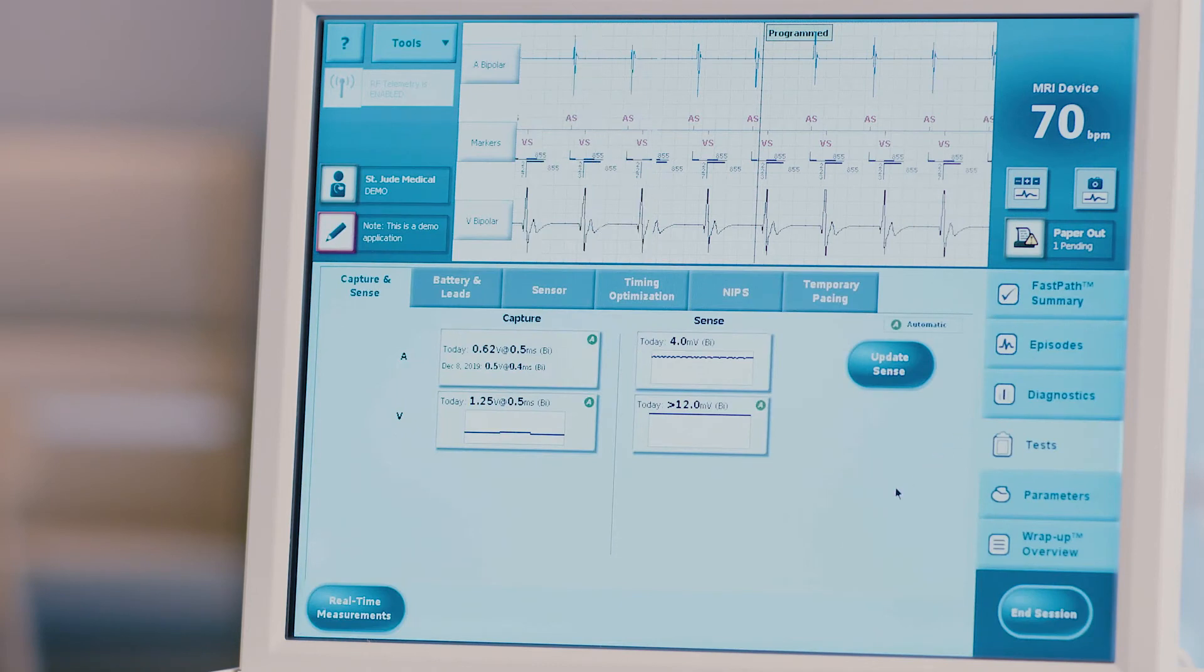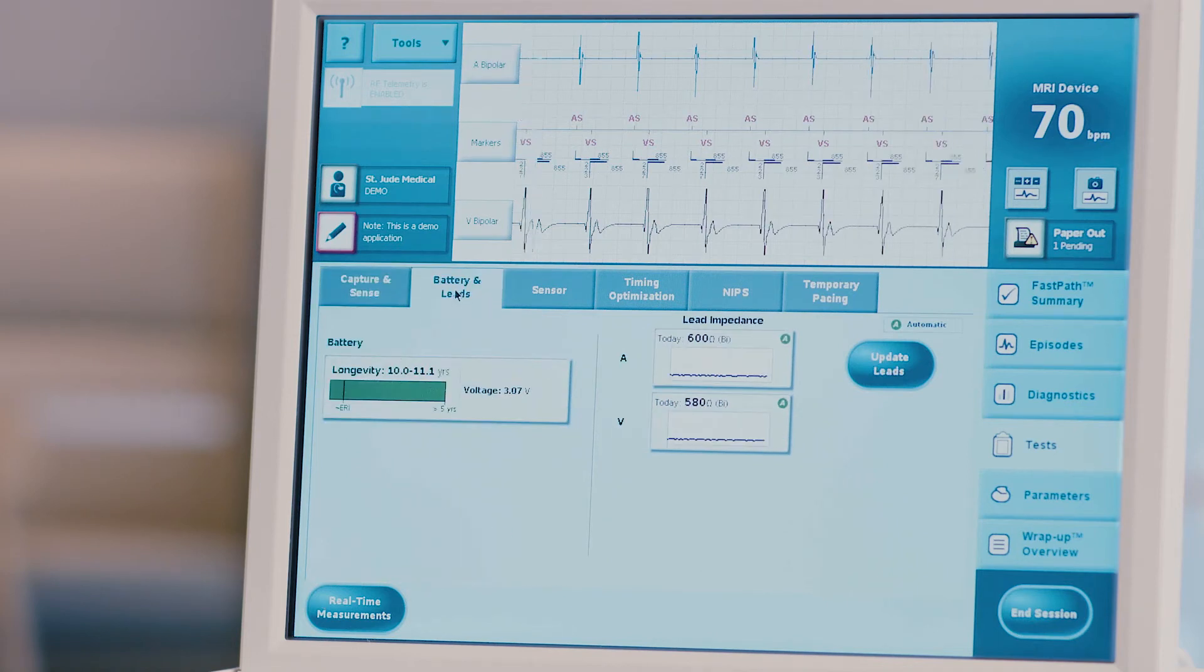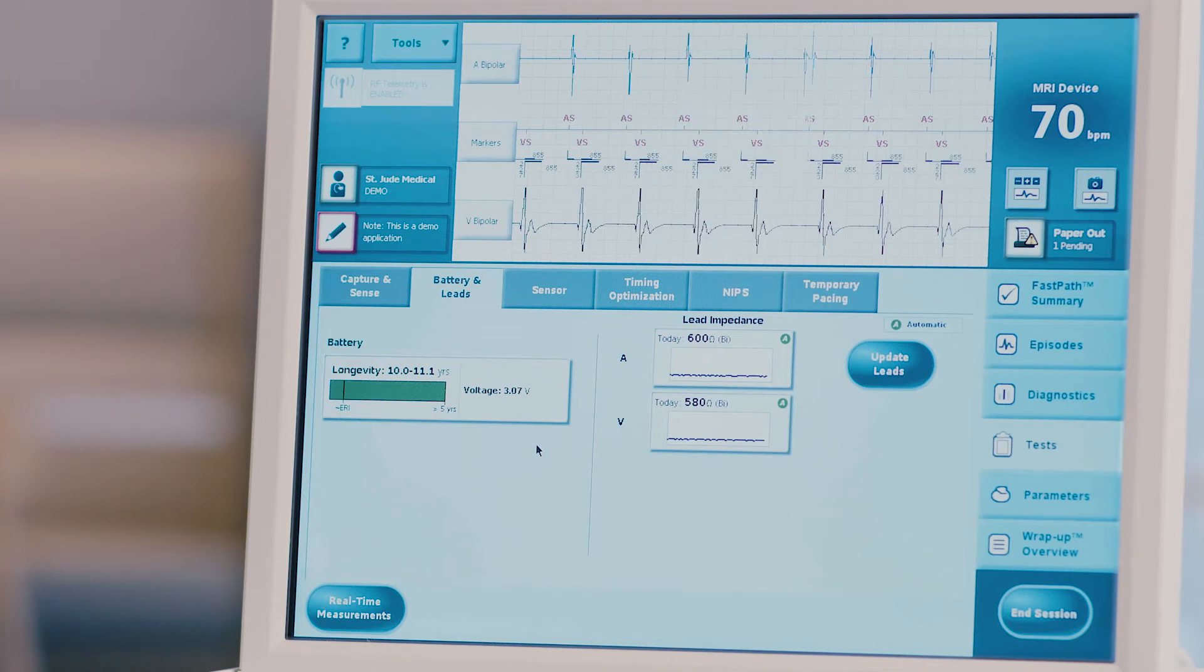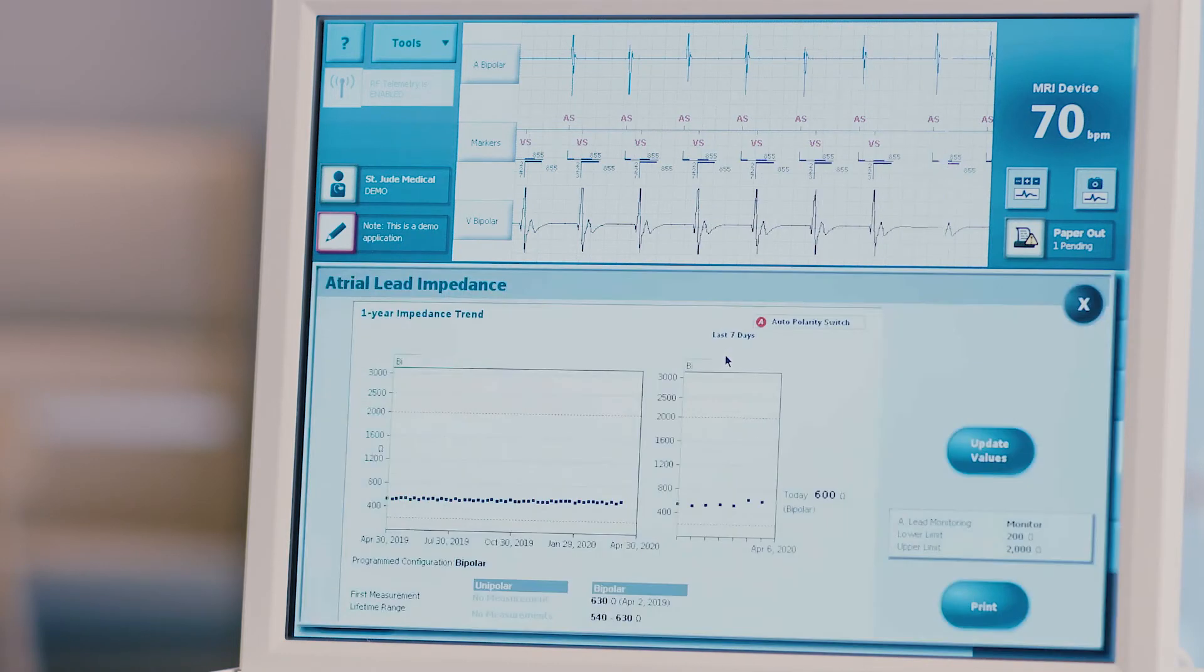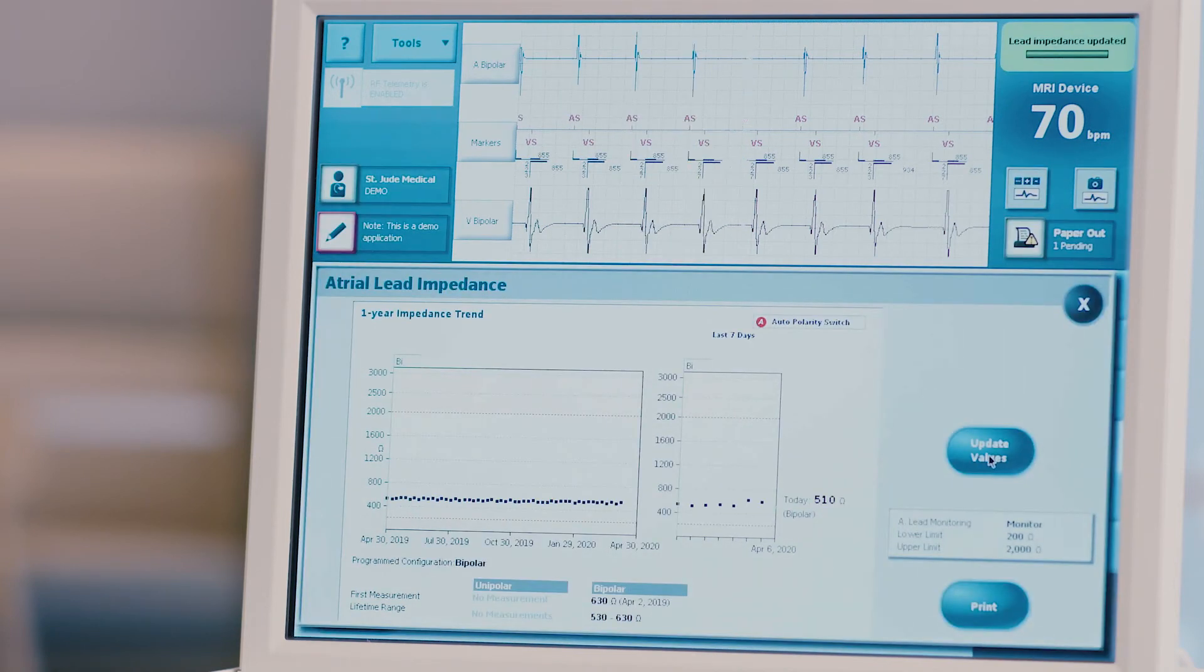Any measurements obtained during testing will be recorded. Repeat this process for any necessary testing that was not automatically performed upon interrogation. Press the battery and leads tab at the top of the screen to perform lead impedance testing if necessary. Choose the desired lead for testing and press the update lead button. This test will run automatically and the measurement will be displayed. Repeat for all necessary leads.